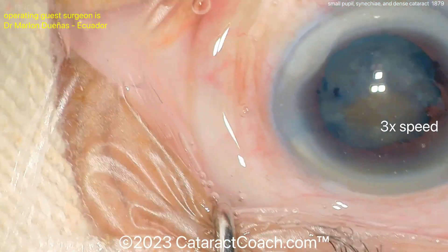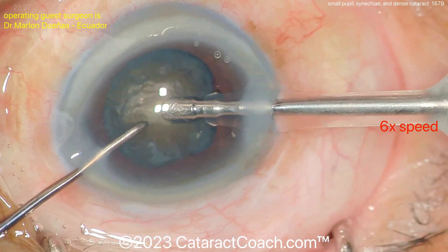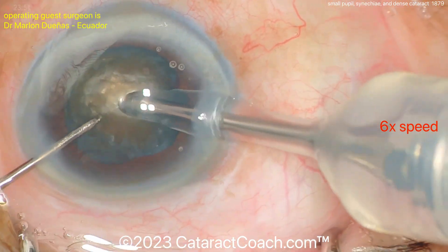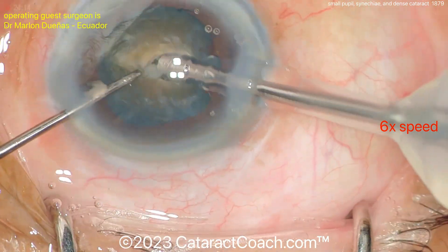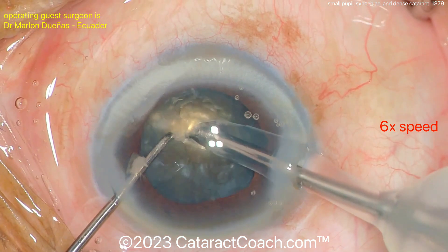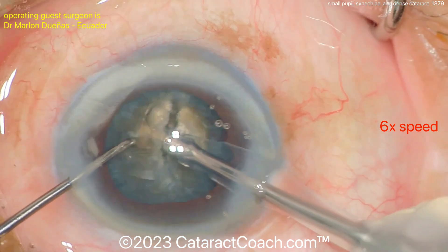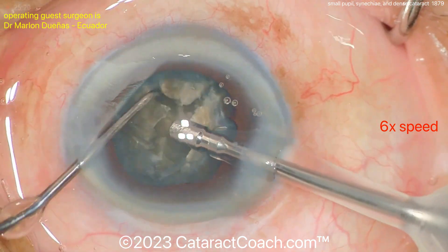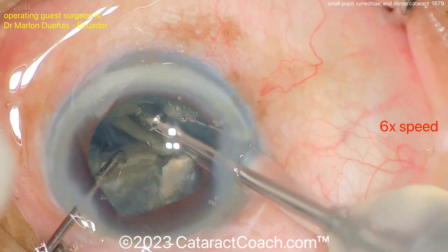There's the lens — a little hydrodissection to see if you can rotate it, then more hydrodissection, always a good thing. Now the phaco part, speeding the video up even faster. The phaco is relatively routine — a nucleofractis technique with a pit being buzzed in, then a chop. Using a submarine-type chop technique: really bury that phaco probe to get great occlusion and split the nucleus.